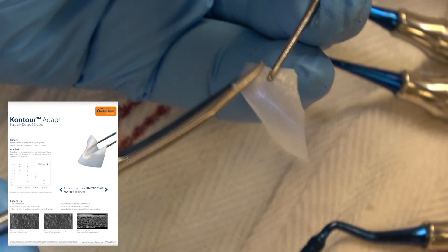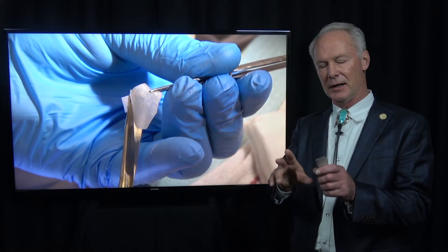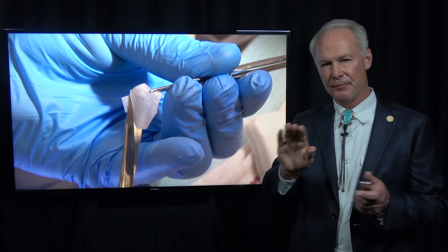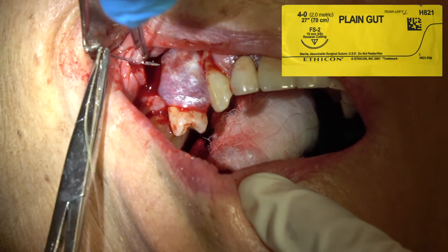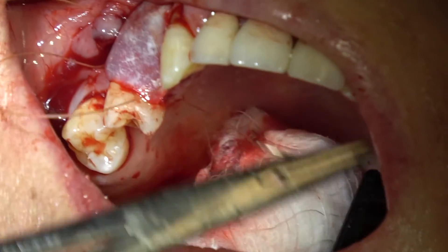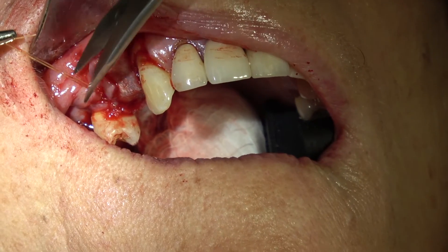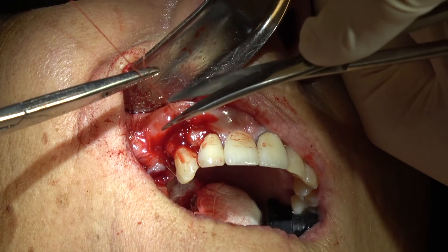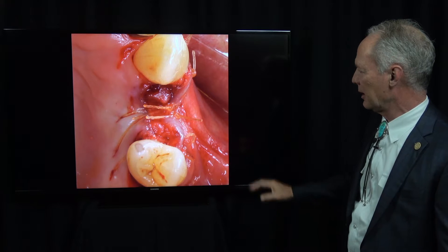This is contour adapt resorbable collagen membrane. What I like about a membrane is I don't want it to have memory like a starch shirt. When it gets wet, I want it to adapt to whatever surface you place it on. I hate it when a membrane springs up — you want it to contour and lay over the bone graft, and this does very well. Then I'm suturing with 4-0 gut suture. You want to over-contour it just a little bit. Primary closure is important, but I'd rather have the blood supply than reflect all the tissue away from the bone.